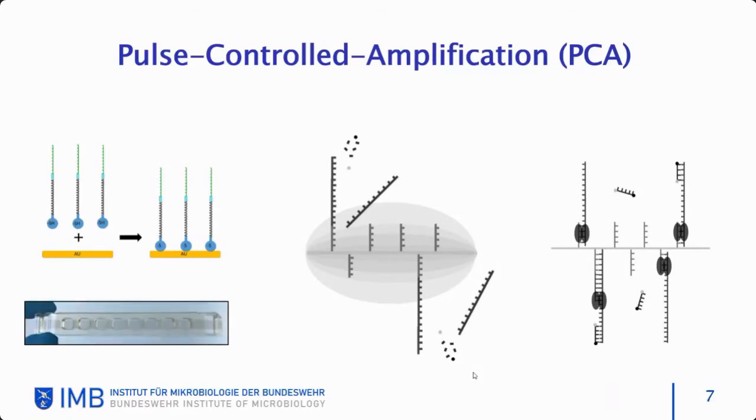And the technique is essentially a chip-based technique. This is a picture. This is almost the size of the actual chip. It's maybe a teeny tiny bit bigger. And so this is a prototype chip. It's a plastic chip, and it has 8 cavities. And the wires are located at the bottom of each of these cavities.